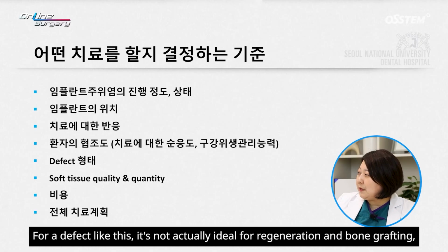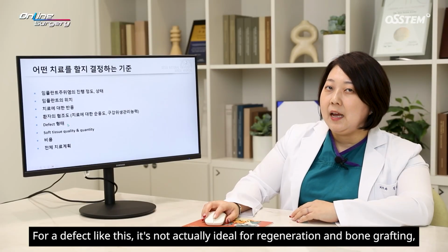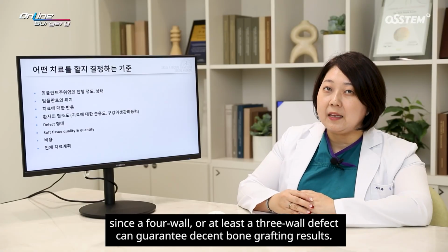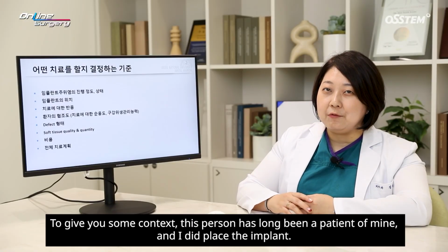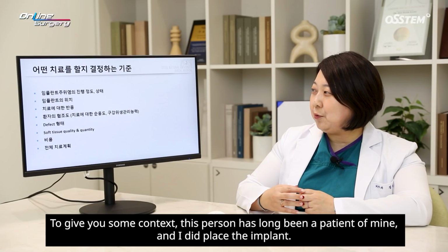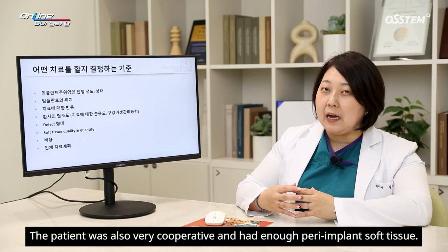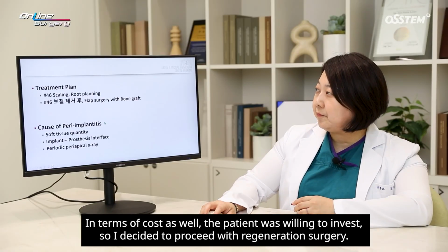For a defect like this, it's not actually ideal for regeneration and bone grafting, since a 4-wall, or at least a 3-wall defect can guarantee decent bone grafting results. To give you some context, this person has long been a patient of mine, and I did place the implant. The patient was also very cooperative and had enough peri-implant soft tissue. In terms of cost as well, the patient was willing to invest, so I decided to proceed with regeneration surgery.